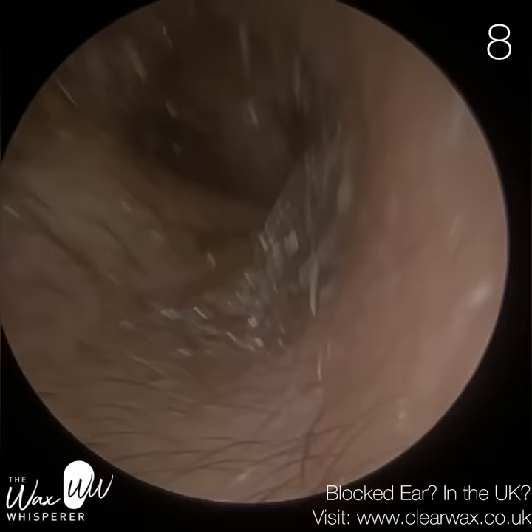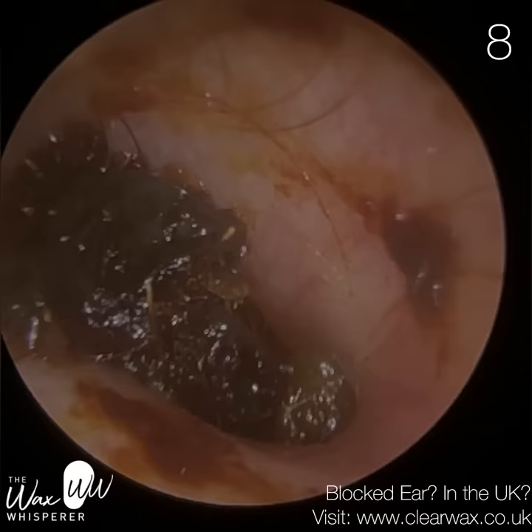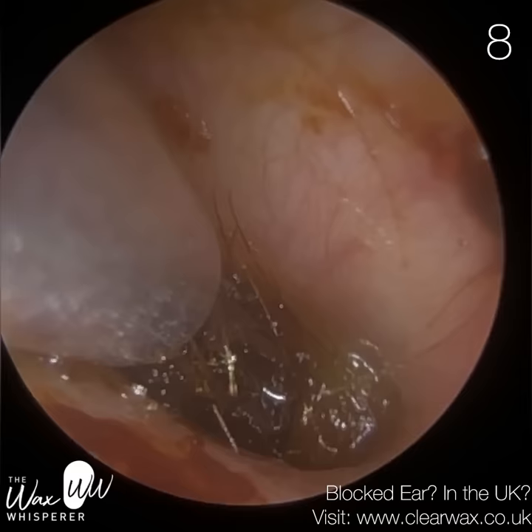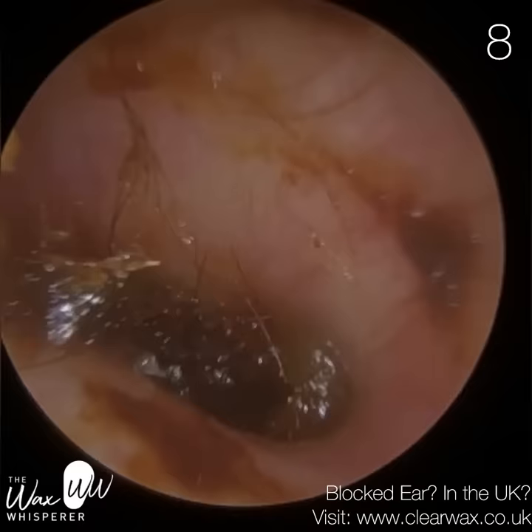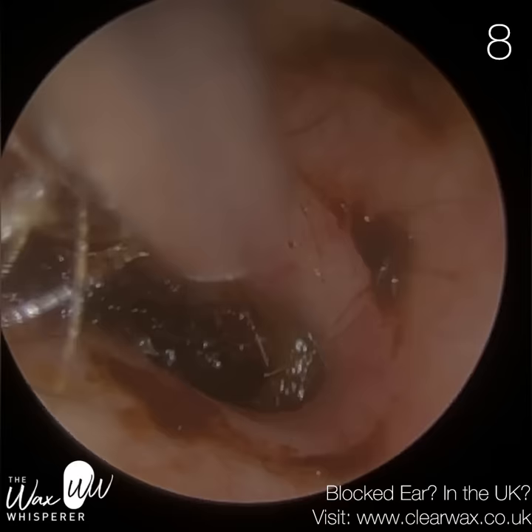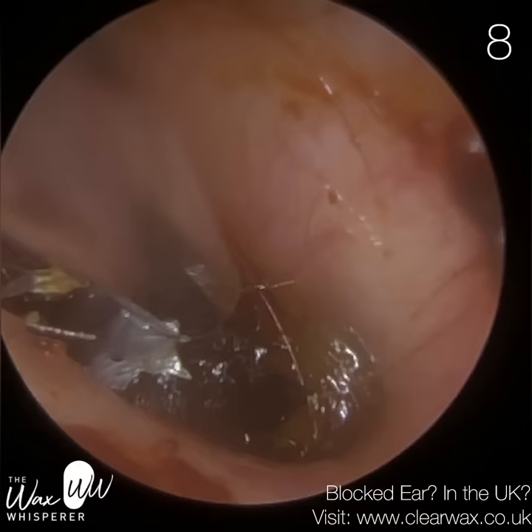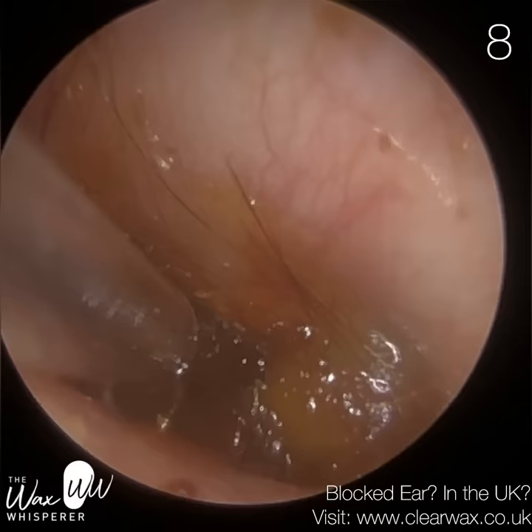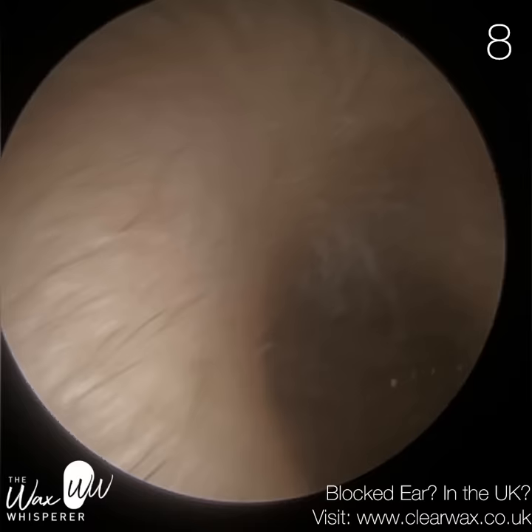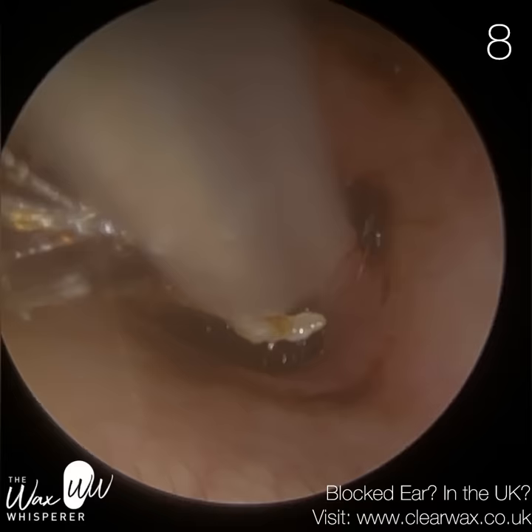It's difficult to remove this because of how narrow and bendy the ear canal is. We're using the full Zoellner suction probe, and with very little space — if I go any further, it's probably going to touch the sidewall. The diameter of the Zoellner suction probe is around 2.1 millimetres, so this patient's ear canal near the eardrum is roughly 2.1 millimetres in diameter. I've reverted to the fine end — I believe it's 1.28 millimetres, gauge 18. We are able to insert that further, though I still can't fully see the eardrum. There's a little bit of wax left in the top left corner but I'm going to successfully remove all of this.